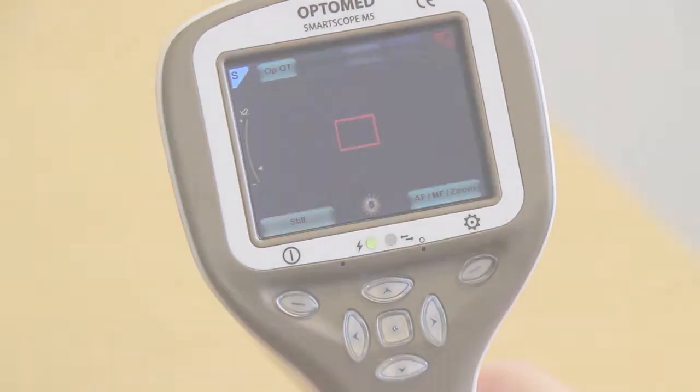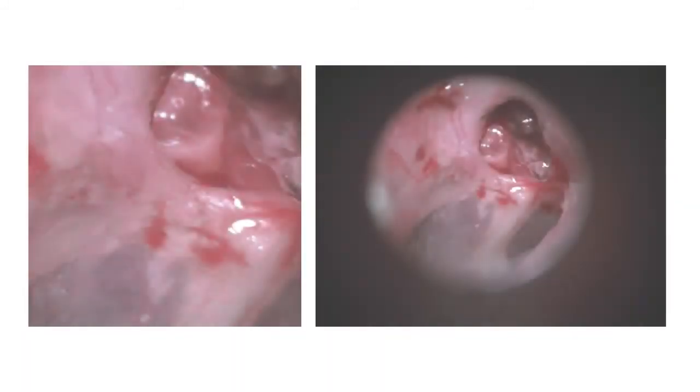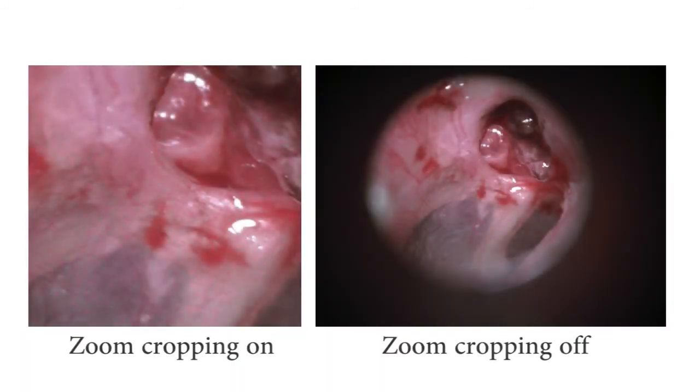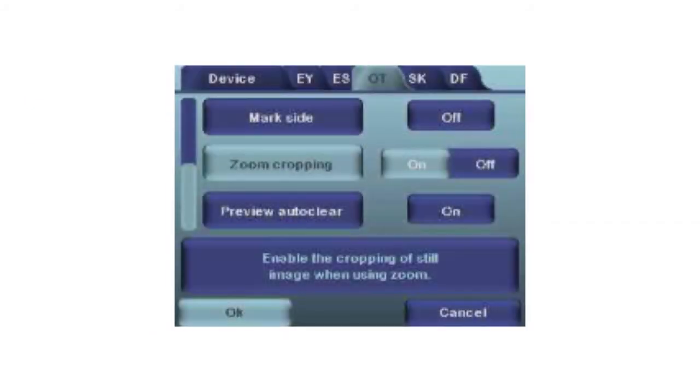Zoom cropping: when zoom cropping is enabled, the camera will save the zoomed area instead of the entire image area. By default, zoom cropping is turned off. When activated, the camera will save only the area that is visible on the camera screen when the user has zoomed in, rather than the whole image.